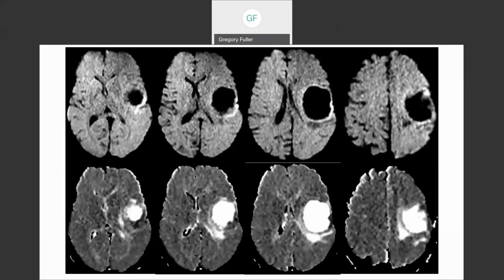I'm not really the pathologist. I know our neuroradiologists know these sequences. Pathologists, you come up with this, okay? I'm wanting sequences here, okay? Just a sequence. What's the top row? What's the bottom row? Okay, I'm not going to beat it to death. The top row is DWI, diffusion weighted imaging, and the bottom is the ADC map. Correct, Dr. Cathcart. Now listen, the top is diffusion weighted.